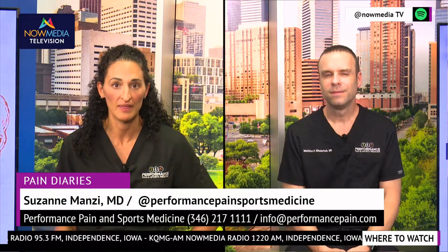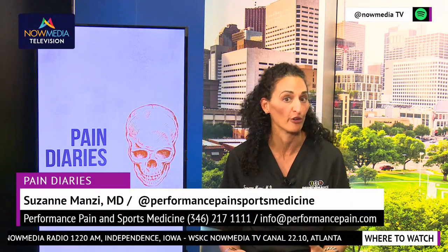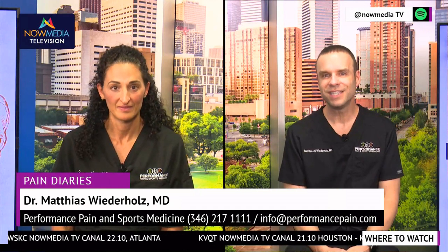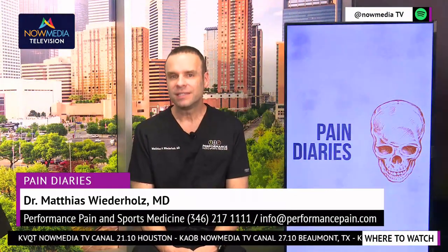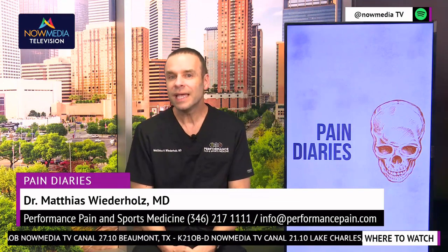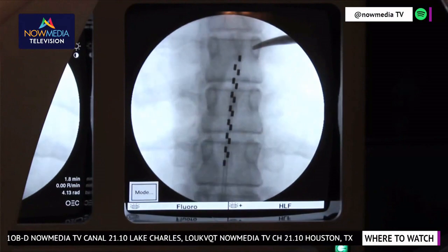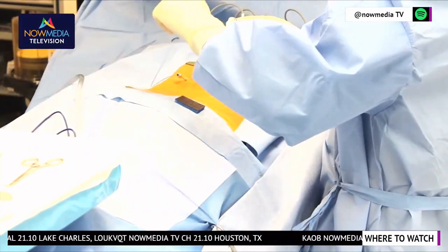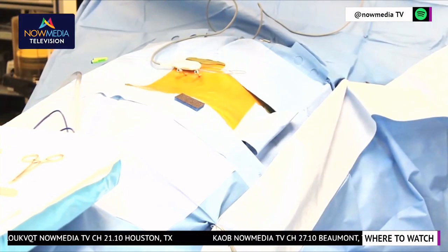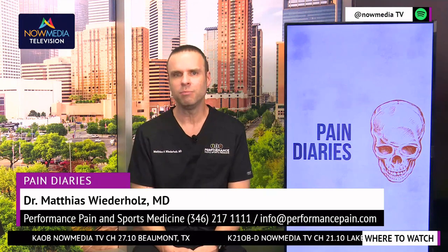Let's talk about the actual conditions and the pain disorders that are really effectively managed with Medtronic spinal cord stimulation. Let's go over the exact diagnoses that are now on label for this. Sure. So the one that we've been doing for the longest time is called post-laminectomy syndrome. This is essentially someone who's had prior back surgery and still suffers from back and or leg pain. Second is complex regional pain syndrome, which we talked about briefly. That's a painful nerve condition, usually precipitated by a previous surgery or perhaps a fracture. So you broke your ankle, and all of a sudden you've got pain, inflammation, redness, swelling, all sorts of nerve-like symptoms that are confusing and very debilitating. And most recently, on-label approved indication, diabetic peripheral neuropathy, so painful neuropathy in patients with diabetes.